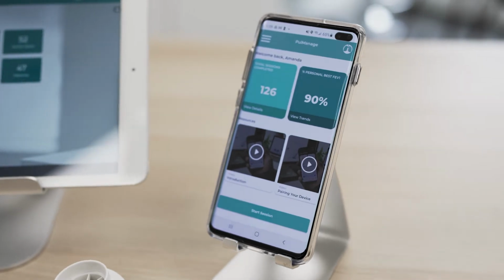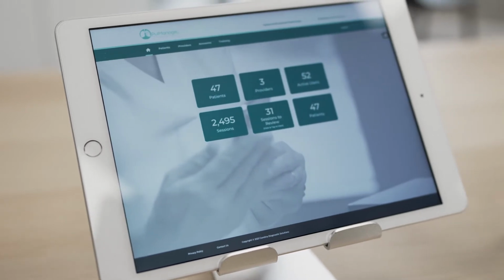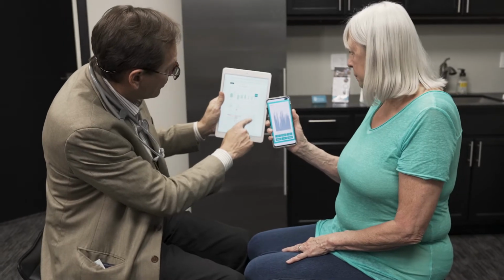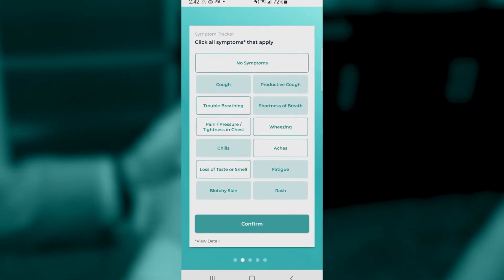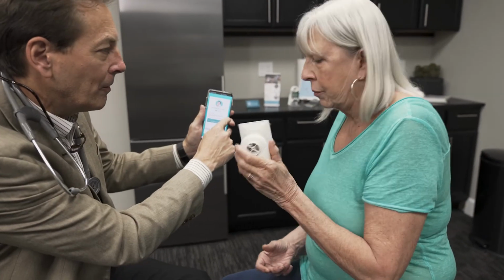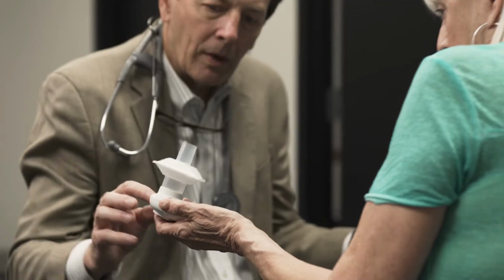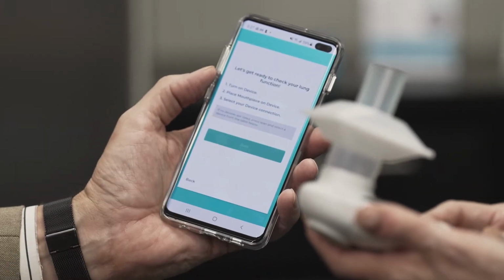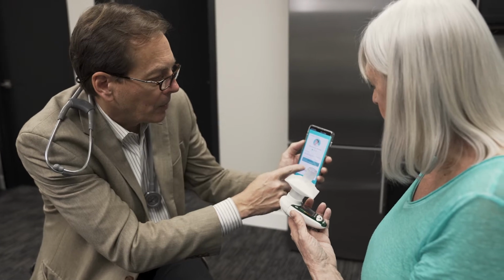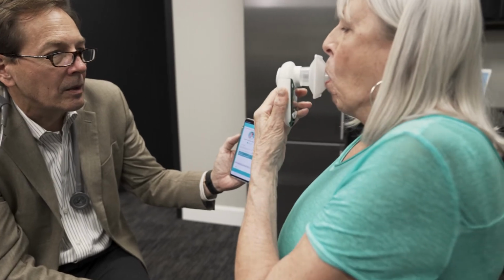There is a symptom tracker on this app that then allows the integration of the spirometry, the flow signals of lung function, with what symptoms are happening in the patient without having to telephone the office and tell them all that's going on. And so we can track symptoms and integrate that with lung function, and that gives the therapeutic implications of what to do. And so to have the telemedicine platform in the physician's office is a way to let these patients remotely monitor, train them, and bring in signals that you need to get the right diagnosis and to treat it correctly. To do this at a patient's home is a real important way to bring technology into healthcare improvement.